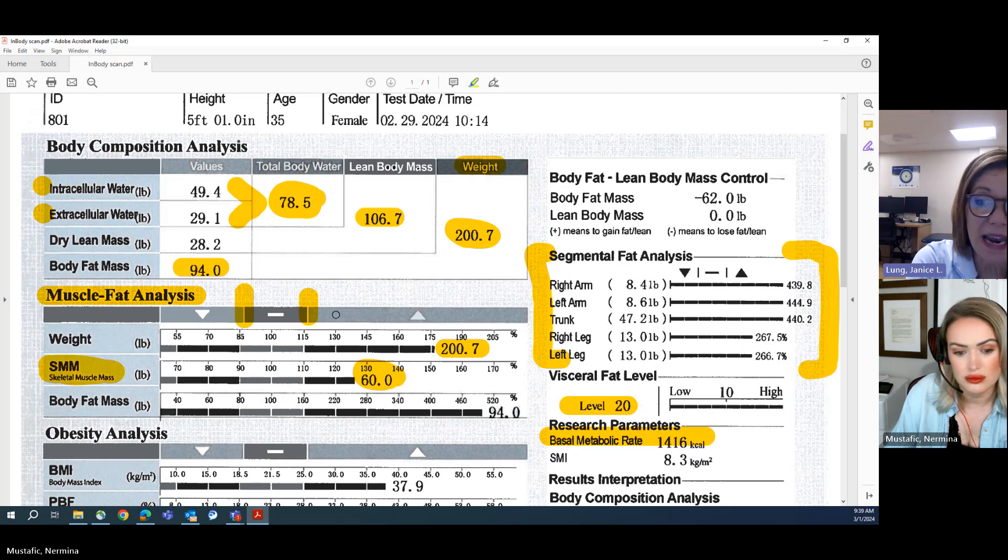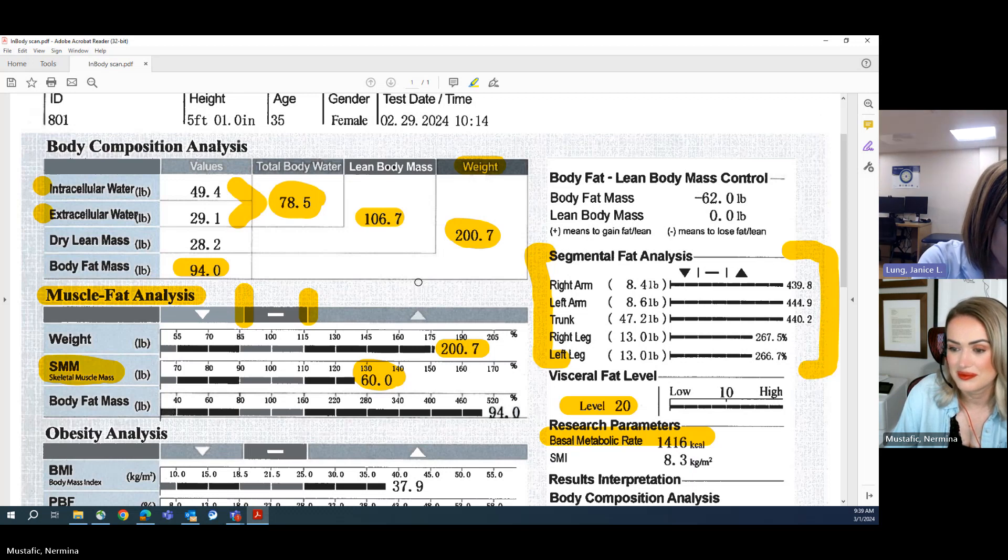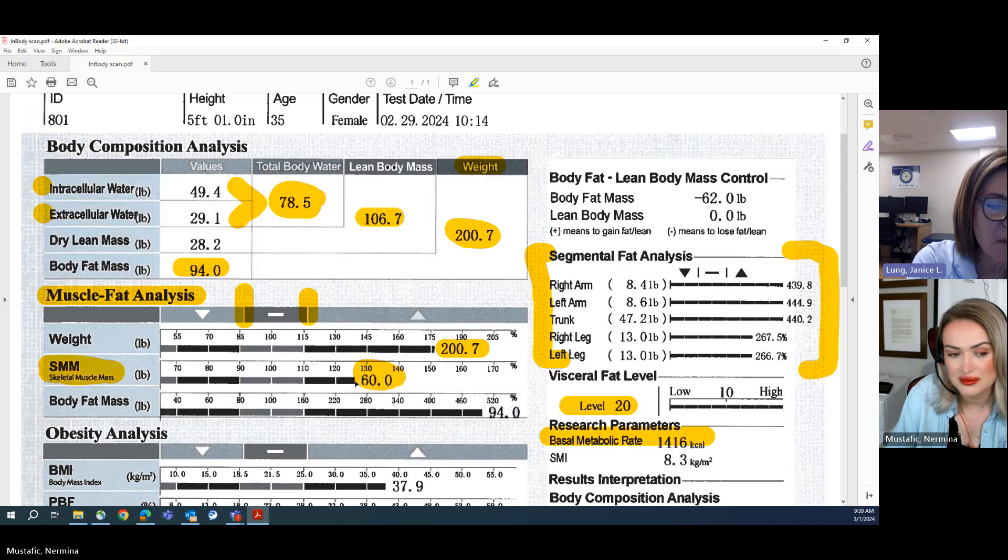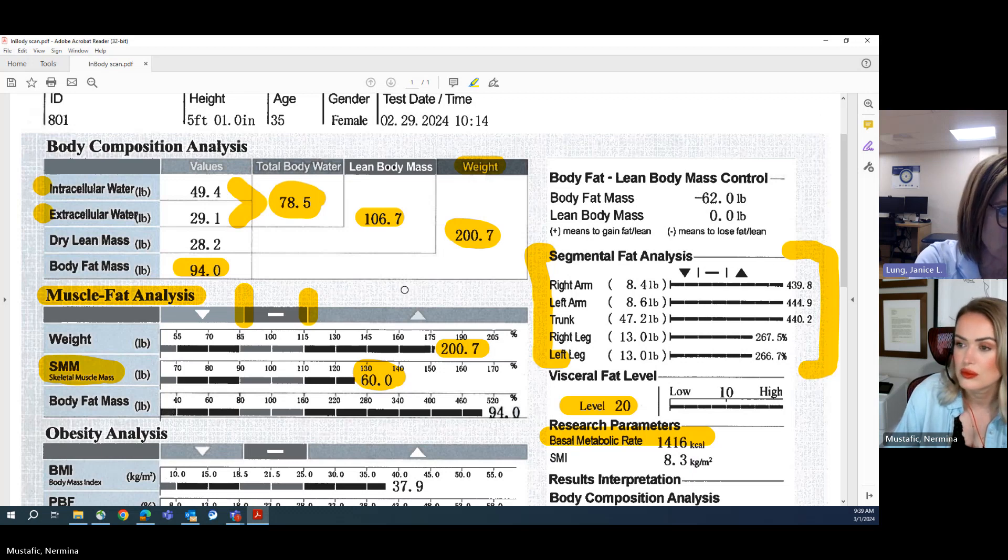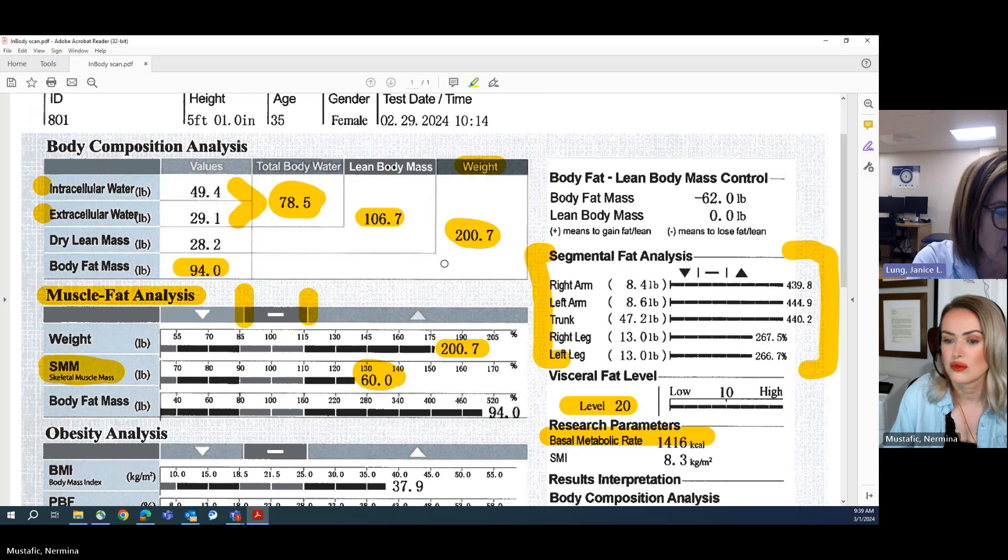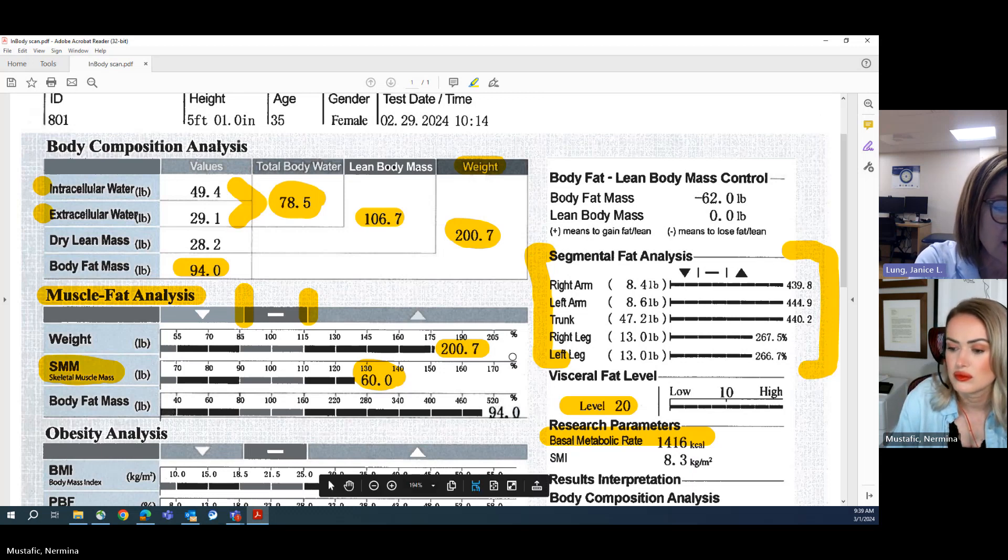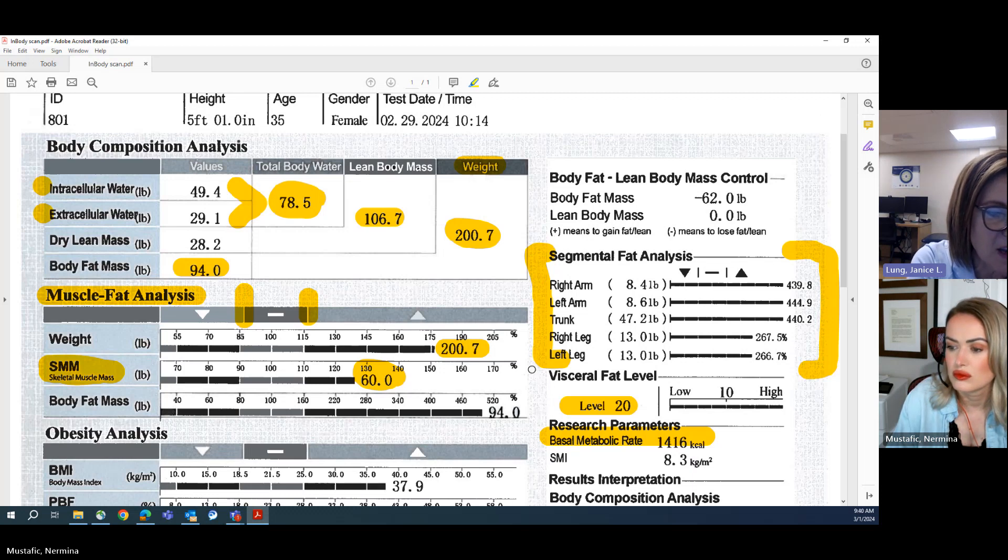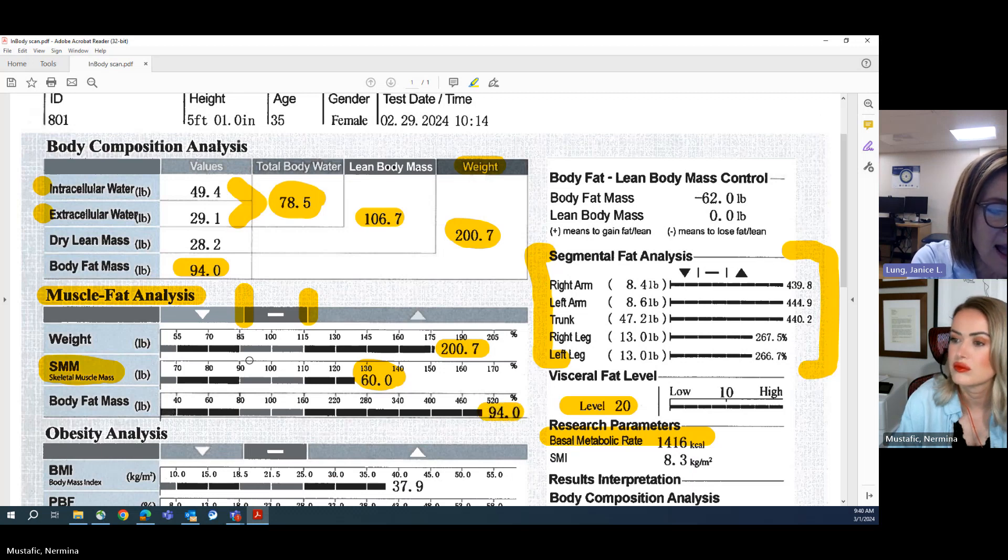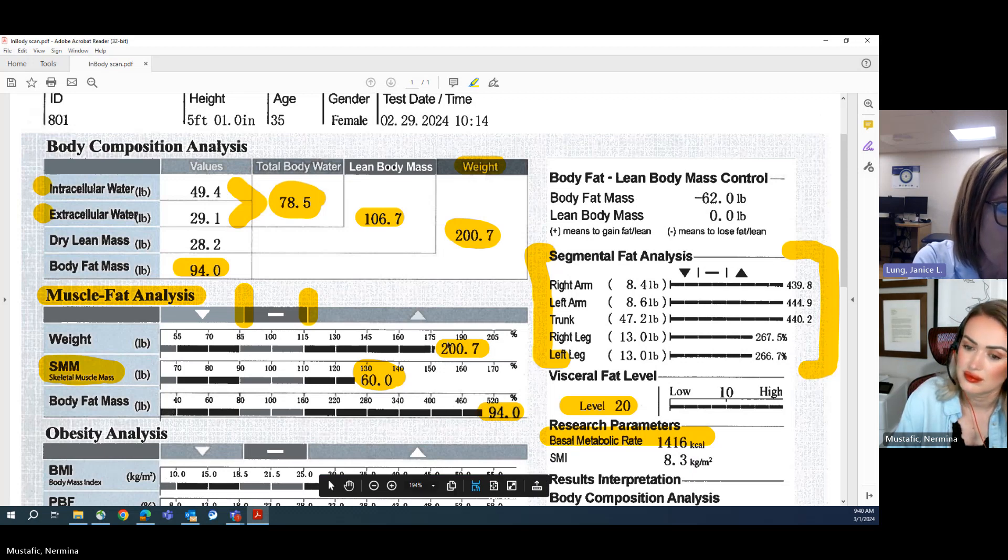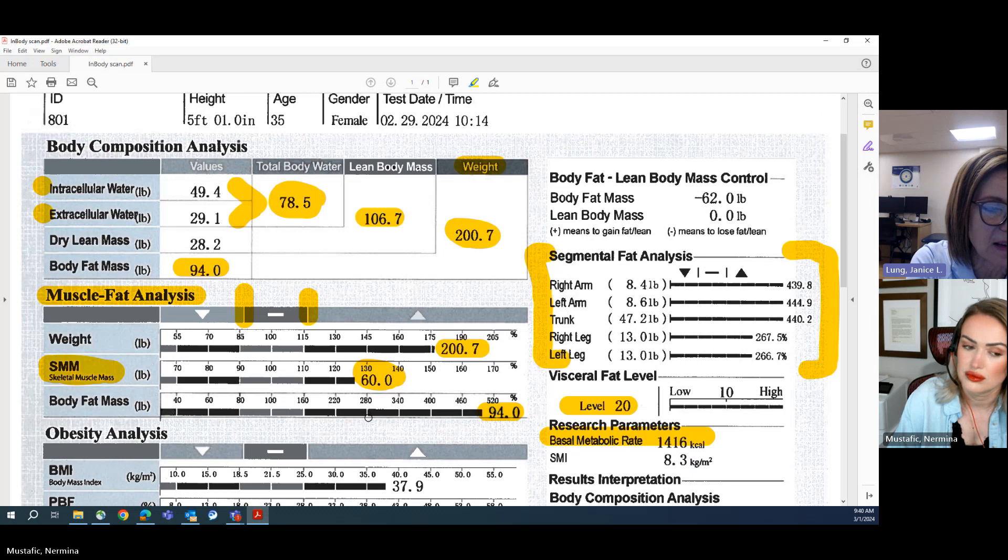This muscle mass of 60 pounds is also outside of this normal range. Well, that's a sweet number right there, because you can see this person has incredible muscle mass. They're at the 126th percentile for women of their height, and that muscle mass is going to be an asset. That's going to help this woman as she goes about her fat loss work that she has. And then again, there's that fat mass kind of scaled out or charted out as well. If you look at these three numbers stacked up against each other, you see that they kind of make a shape of like a C. What this person would like to do is bring down her fat mass, bring down her overall weight.